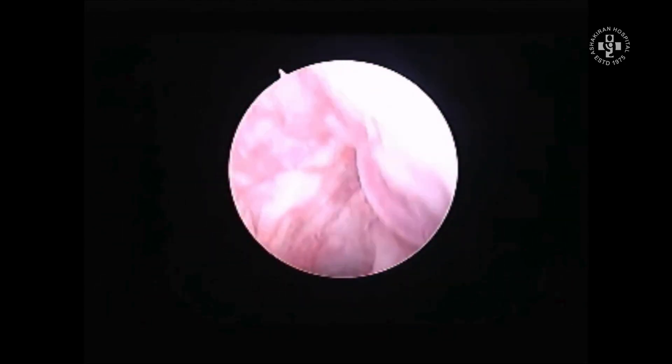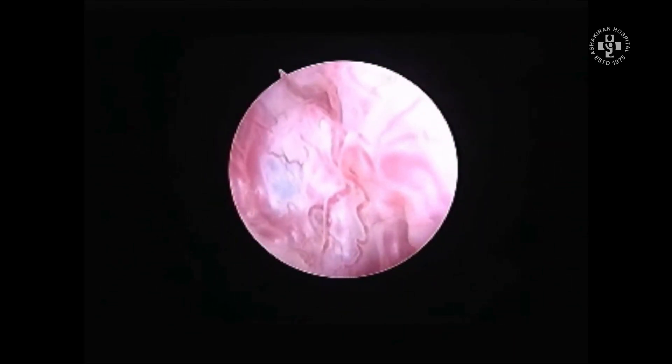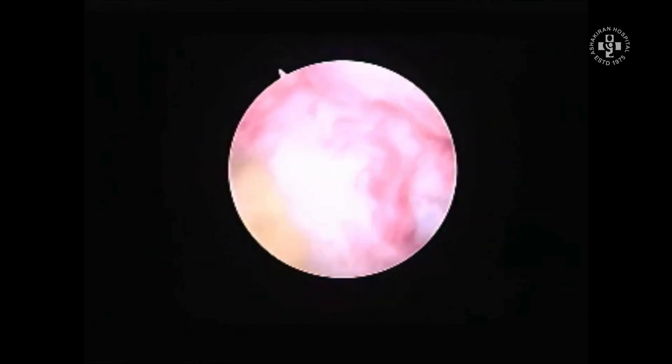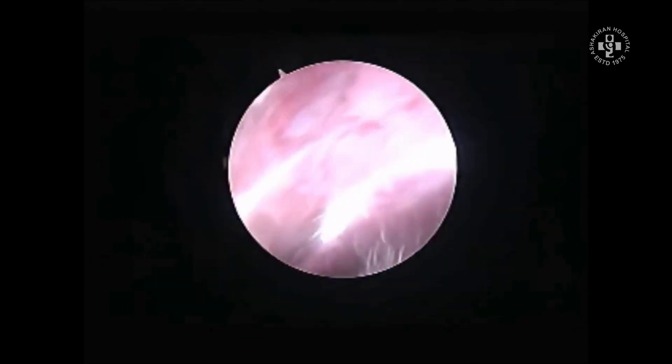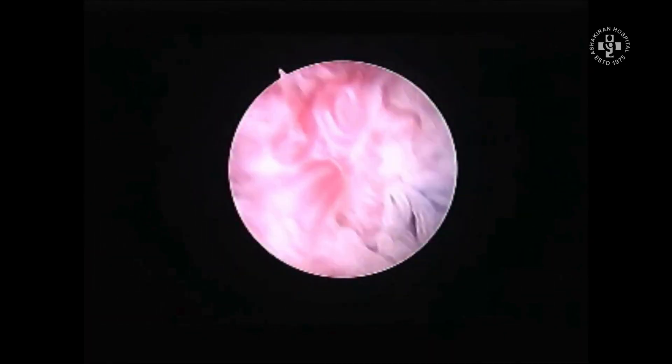If the mucosal folds are absent or flattened, there is a chance the patient may achieve pregnancy, but the chances of ectopic pregnancy will be on the higher side. These are particularly interesting findings from fimbrioscopy as well as falloposcopy. This video shows what you can know about tubal patency documentation by hysteroscopy and the importance of fimbrioscopy. Now coming out, you can see the beautiful fimbria lying in the peritoneal cavity and the vasculature around it, which means this patient is having a good fertility outcome — just give ovulation induction and she will conceive.